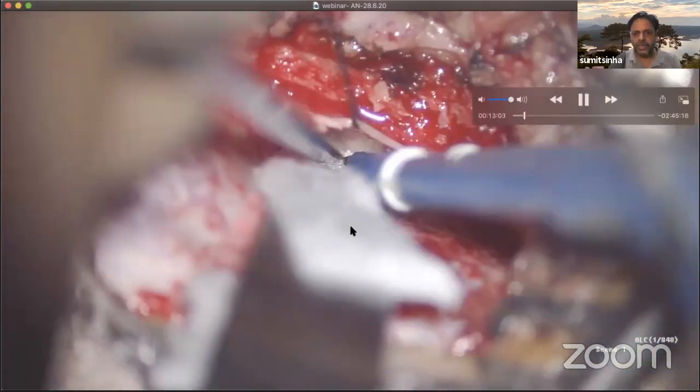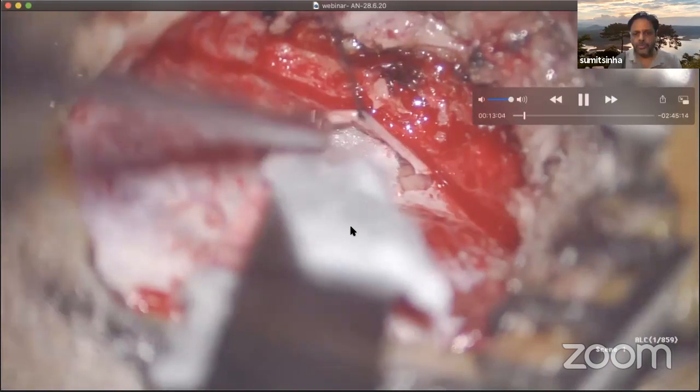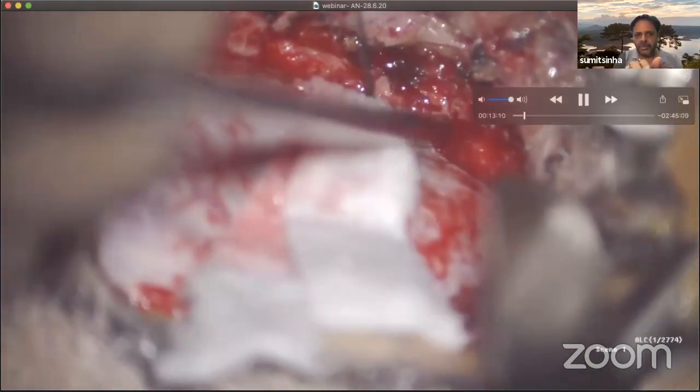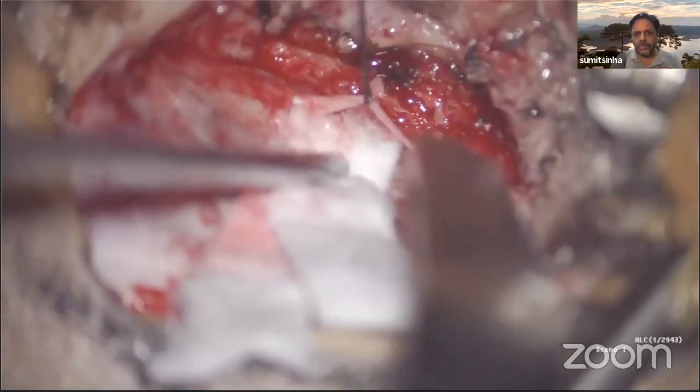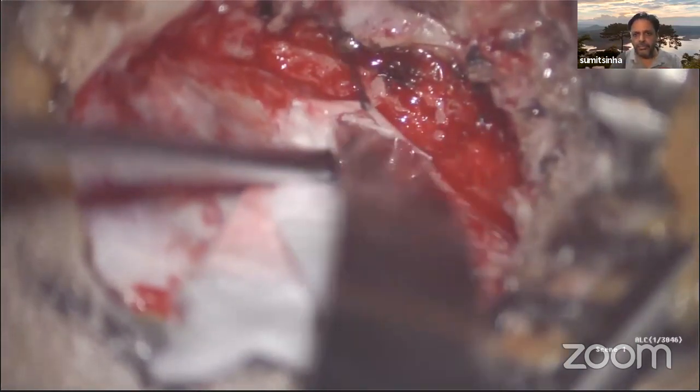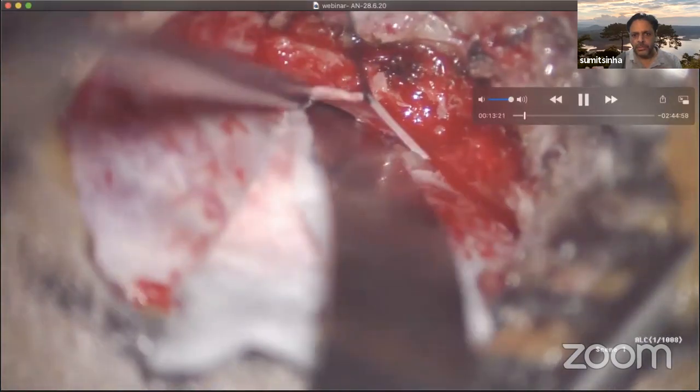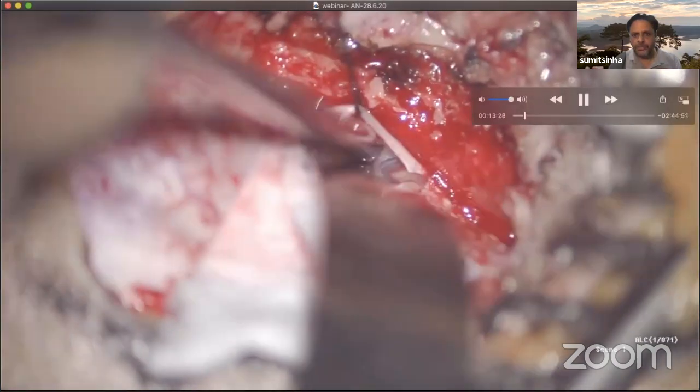My aim is to insert my cotton patty below the cerebellar tonsil, retract it up, and open the arachnoid of the cerebellomedullary cistern. And the moment I do that, you see, life becomes so easy.